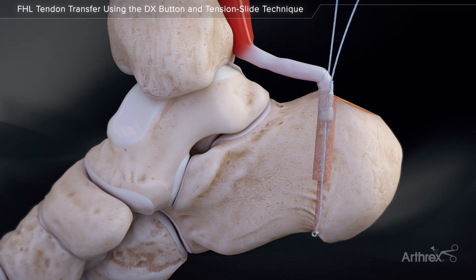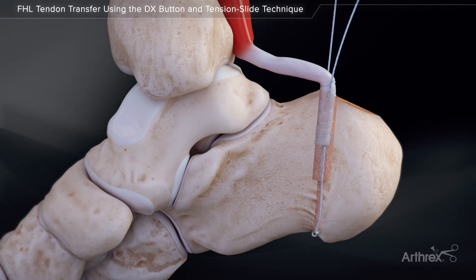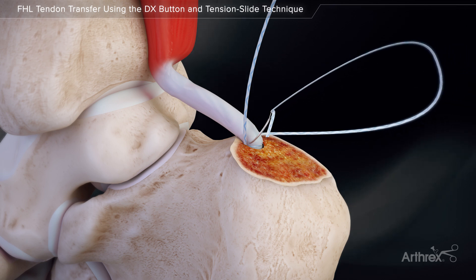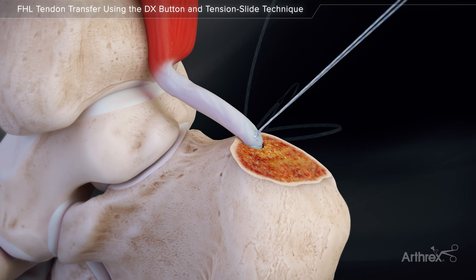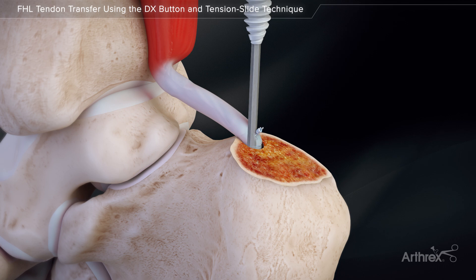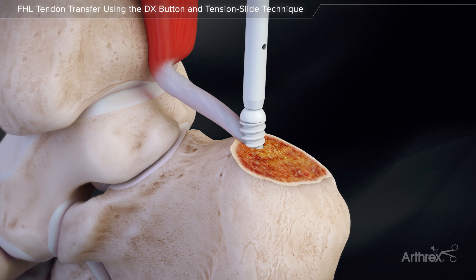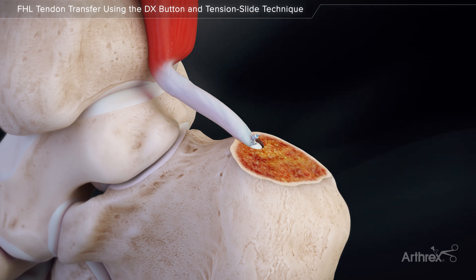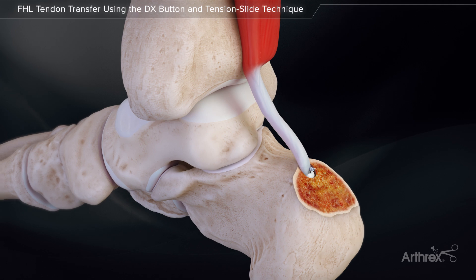Grasp each suture limb and slowly apply axial tension to dock the tendon into the bone tunnel. Once the tendon is fully seated, use the free needle and pass one suture limb through the tendon and tie 3 to 4 knots. Insert a 6.25 mm or 7 mm tenodesis screw for aperture fixation. The screw should sit flush with the cortex. Cut the excess suture and fixation is complete.